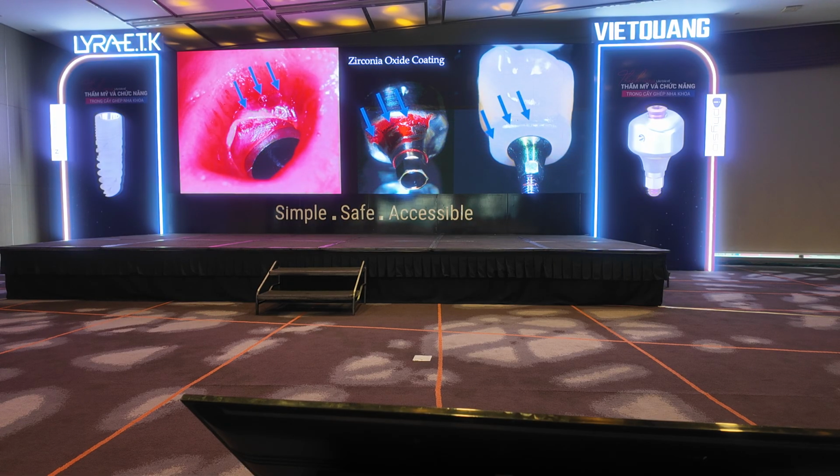We have a healing, we don't have a sealing. I'm interested in a sealing. I need to have a tissue totally adherent to the abutment in order to stop the bacteria, biologically stop the bacteria. Very, very important. And then, when we remove this abutment, we for sure destroy the sealing, and we have to use a zirconia polished, not glazed, as Dr. Fan showed this morning. We can glaze this part and polish this part.